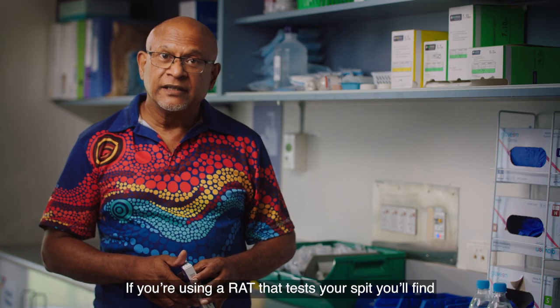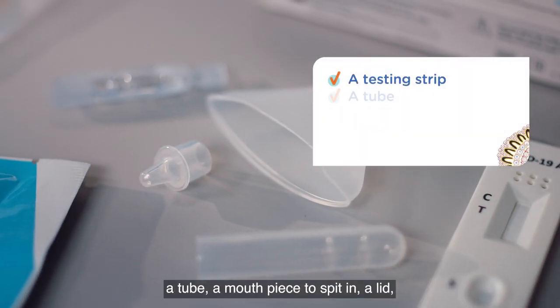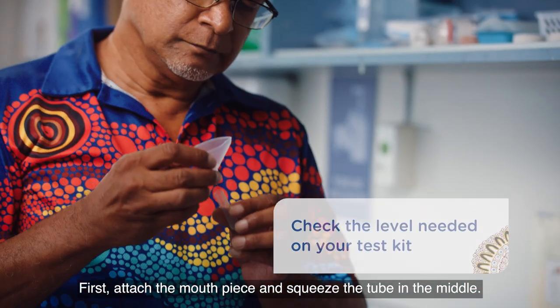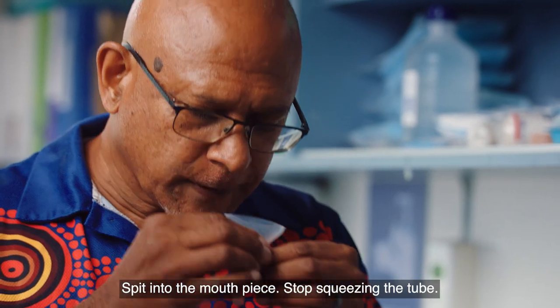If you're using a RAT that tests your spit, you'll find a strip that will show if you have COVID-19 or not, a tube, a mouthpiece to spit in, a lid, and a small pack with liquid called the buffer. First, attach the mouthpiece and squeeze the tube in the middle. Spit into the mouthpiece, then stop squeezing the tube.